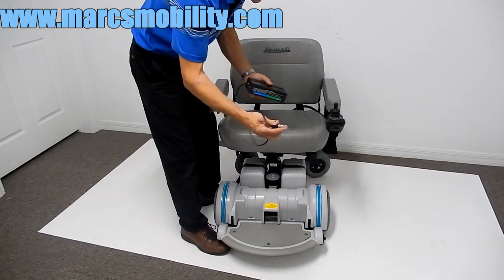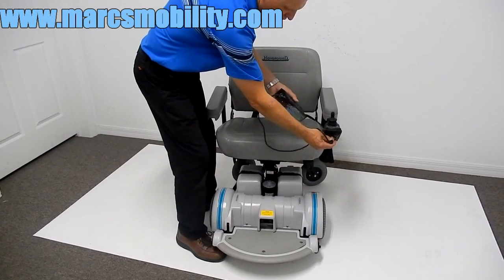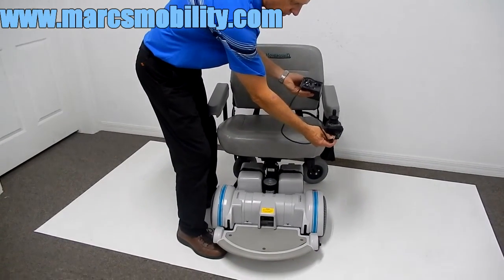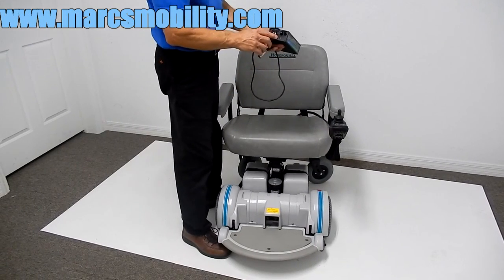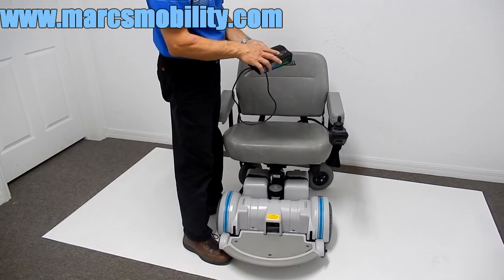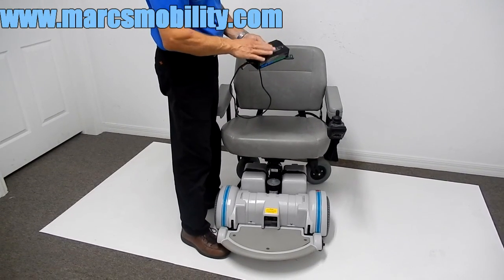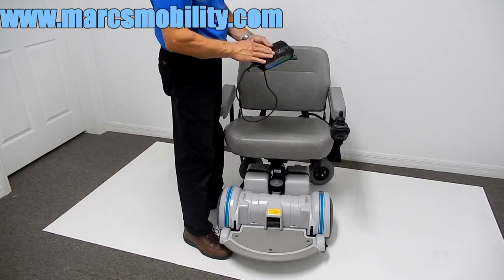To charge this chair, the only thing you have to do is take your charger and plug it in at the bottom of the joystick. When the light on your charger turns green, you're fully charged. When the charger stops charging, it will turn off so you're not overcharging the batteries — these chargers know when the batteries are full and turn off automatically.